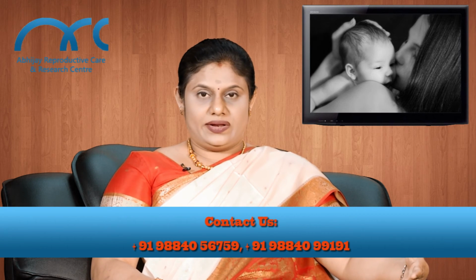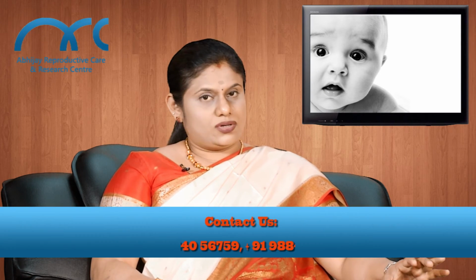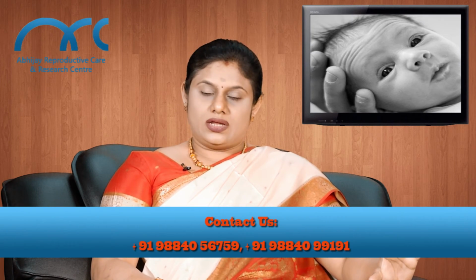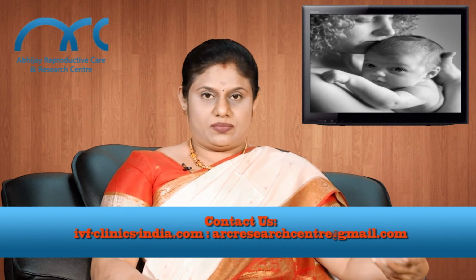For the patients who have repeated implantation failure as a cause of their failure in the ART technique, we recommend them to undergo a diagnostic hysteroscopy to look at the endometrium to make sure that there are no intrauterine adhesions contributing to the implantation failure, and if so, we try to do the adhesiolysis at the same sitting, and once the release of adhesions is made, it would be easier for this female partner to get pregnant.